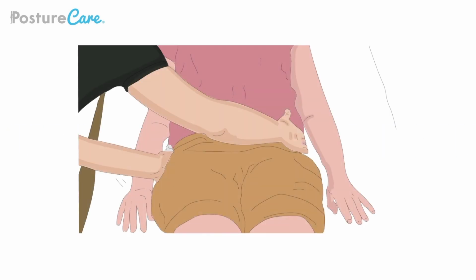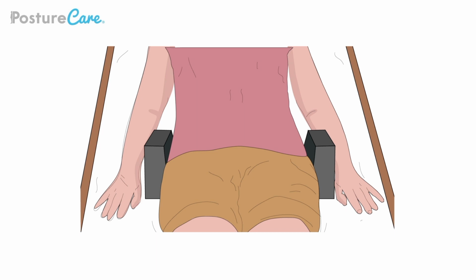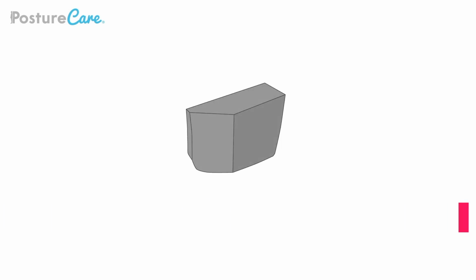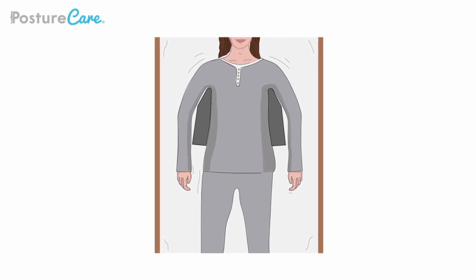Achieving midline. The fundamentals of good positioning comes from the pelvis. By correcting the pelvis to a neutral position, the rest of the body has more chance to gain symmetry. Fit the pelvic pads to the sheet, as in the video, to maintain this position. Thorax support. To support the trunk, please place the thorax support firmly next to the patient's trunk as shown.